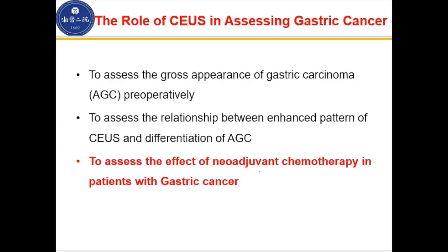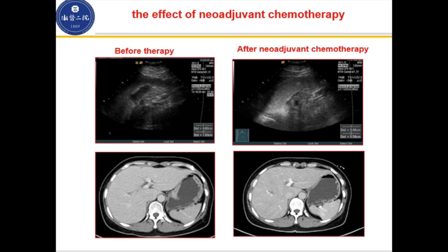And the next part is the role of CEUS in assessing gastric cancer, to assess the effect of neoadjuvant chemotherapy in patients with gastric cancers. Now I'd like to show some cases to you.